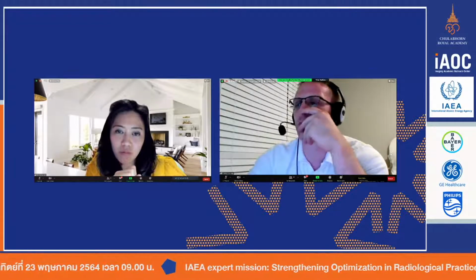The DRL for mammo standard 4 view is shown as an average of the 4 views. Yes, per examination. Yeah. So it's not the sum. It's not 4 views, because that would be 2, 4, 6, 8.